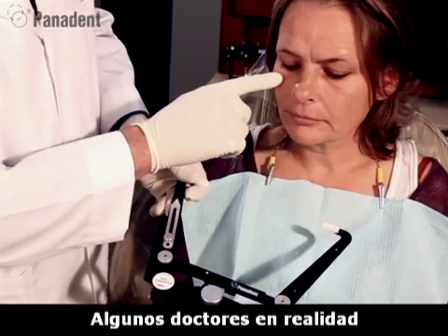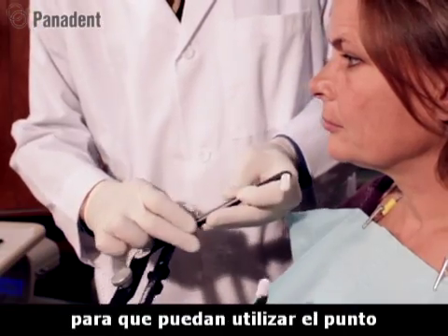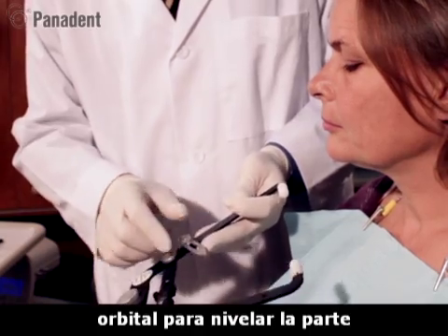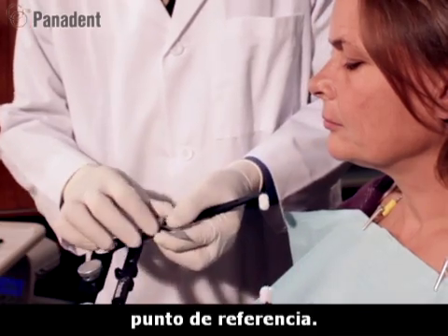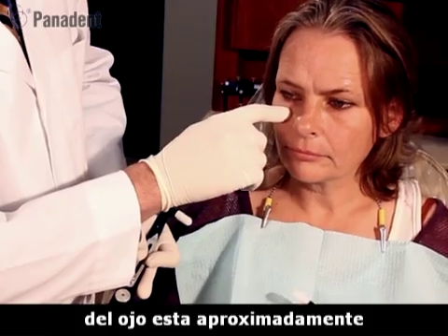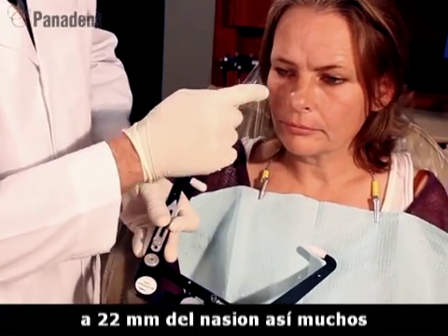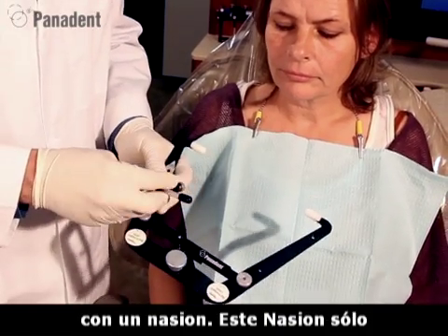Some doctors have palpated the lower border of the eye to put a spot on the nose so that they can use an orbital pointer to level the front end or to designate the third point of reference. Research has also been done to show that the lower border of the eye is approximately 22 millimeters below nasion, so many systems have been standardized with a nasion relator.